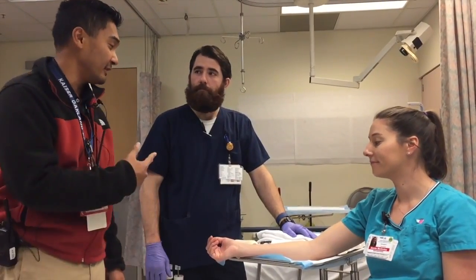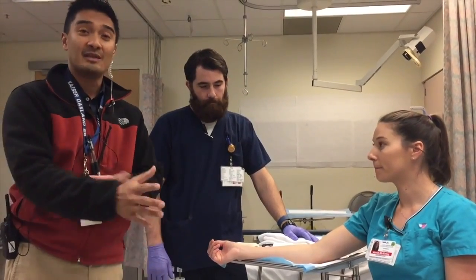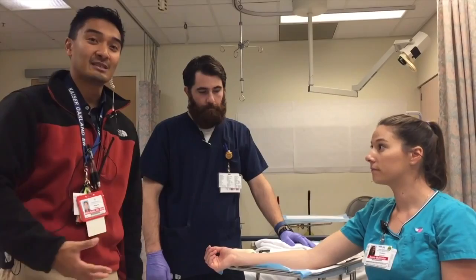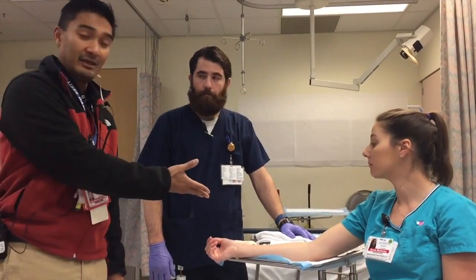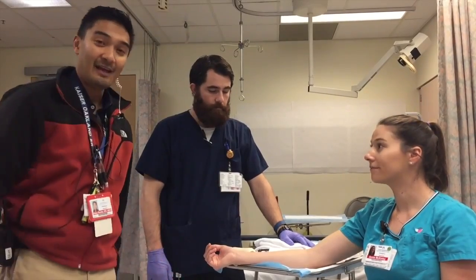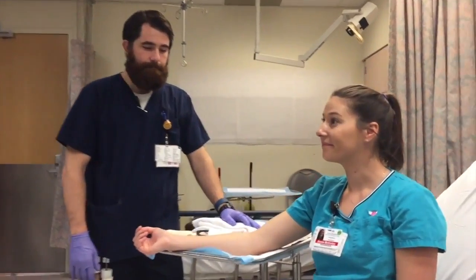I think today we're going to do an ulnar gutter. This is just one type of splint. There's various other ones, thumb spica, volar splints, but today is just an upper extremity splint. Kevin is going to demonstrate that on Annie, along with the equipment that we use. I'll leave it up to Kevin and Annie. Take it away.